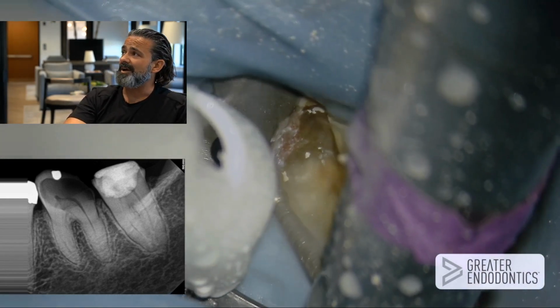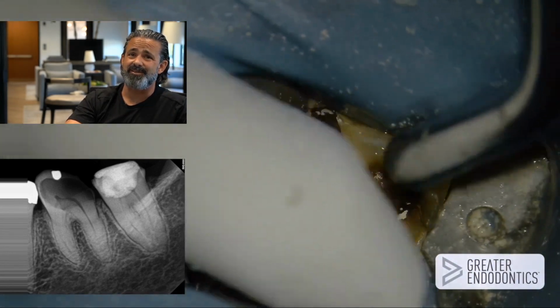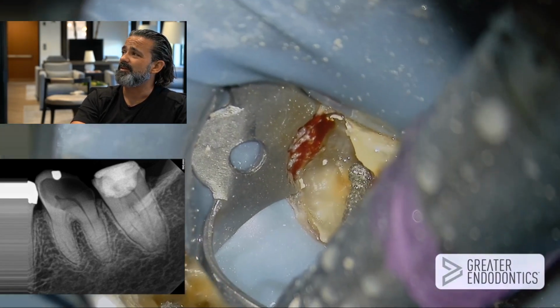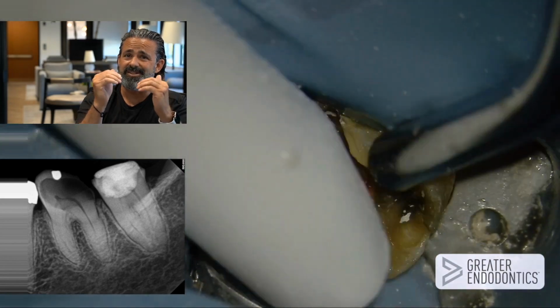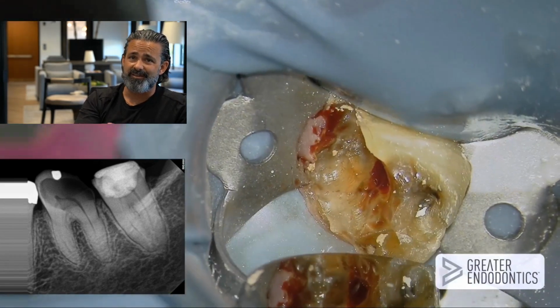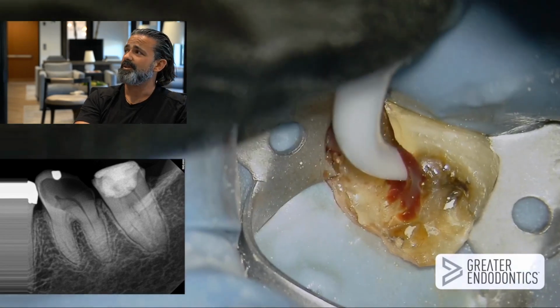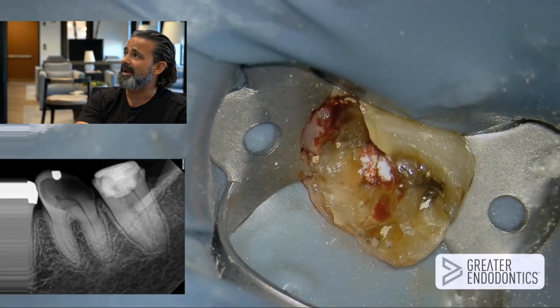And so I'm removing down, and I can even see the eminences of the buccal and the mesial and the distal roots. I can start seeing the invagination of the furcation along that buccal wall. I don't like that. It is hard. I'm already into the furcation zone, and I'm already causing exposure. You can see it's hyperemic, so the giveaway is this was an irreversible pulpitis case.